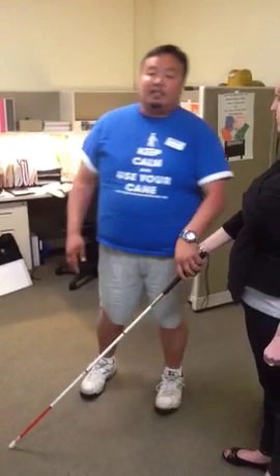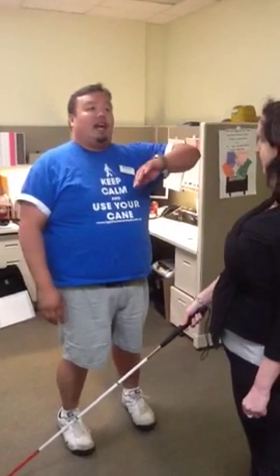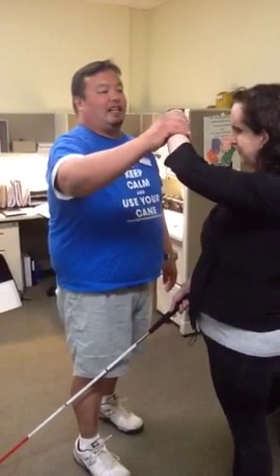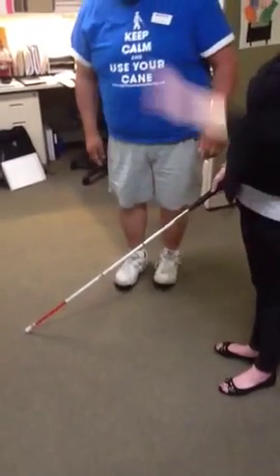Now it doesn't tell you anything above the cane, because it could be a tree branch or a little ornament hanging. So that's why it's always imperative, at unfamiliar places, to give yourself protective upper technique, which is, like we talked about, just like that. Very good. So if you're in unfamiliar places, you always use your cane with your hand up. Go ahead and put your hand out.